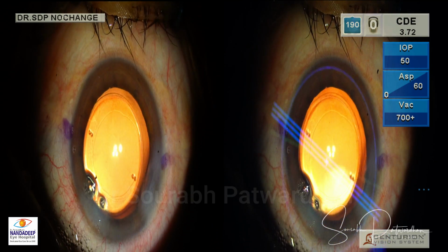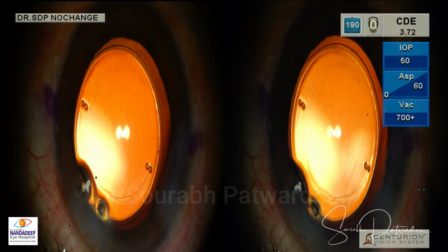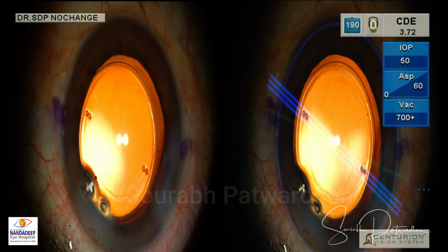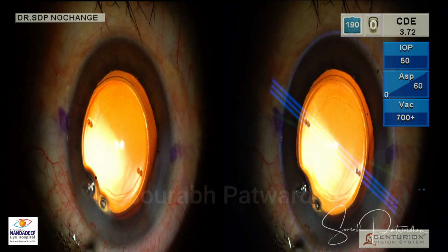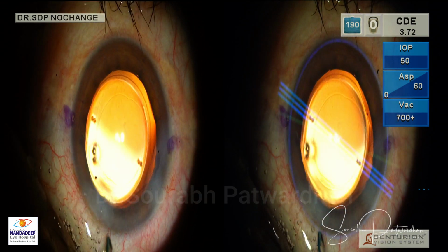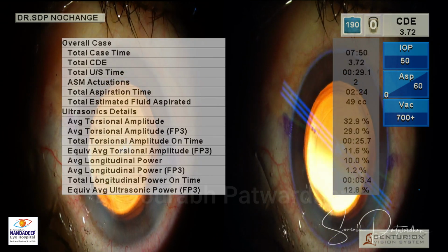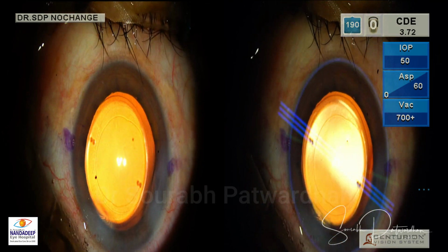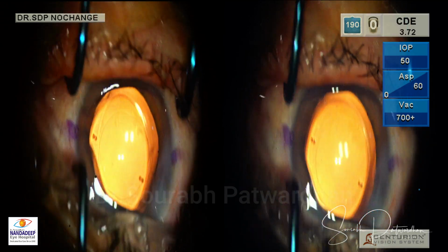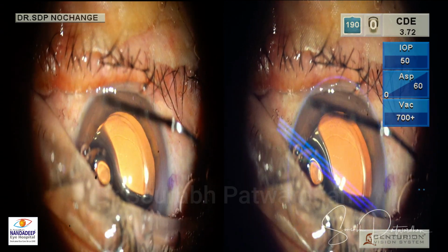Any suggestions to change or anything? Okay, so that's the end of the surgery. I will just push a little bit of Vigamox. Yeah, that's a little bit of Vigamox. I will ask the patient if they can see the light or not. We ask that because if we pressurize the chamber too much, the PL goes off, and that should not happen.